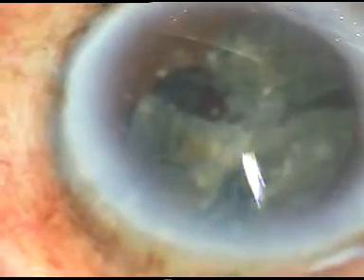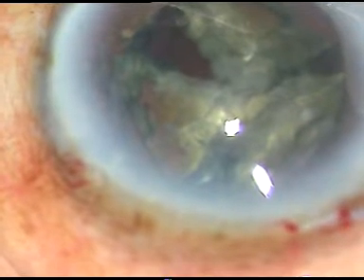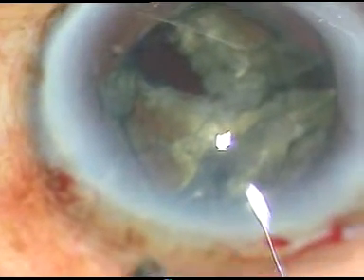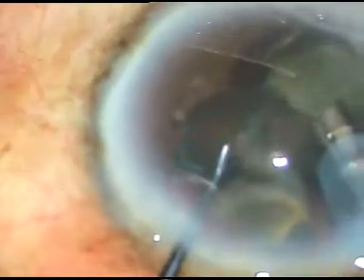What I am doing is I have come out and injected some viscoelastic substance. I am going to use an instrument that looks like a Y, which can more effectively push the iris. I want to push the pupillary margin in case it comes to the phaco handpiece. I have decreased the vacuum to 400 and the flow rate to 40, and now the tendency of the iris to come to the phaco port appears less.